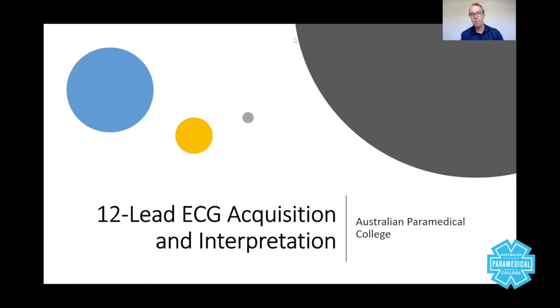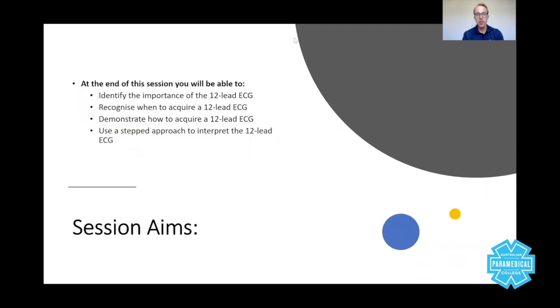So in your career as a paramedic, at some point in the assessment cycle, you are going to need to try and rule out whether the patient is presenting with signs and symptoms of a cardiac condition or whether those signs and symptoms are related to some other medical condition. Now, of course, one of the ways that we do this is through the use of a 12-lead ECG. Now, of course, the 12-lead is part of the assessment process. It does not replace a physical examination, and we would always teach you guys to treat the patient and not the machine.